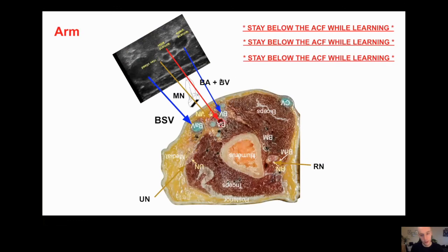This is someone's arm. This is the medial arm. You've got the humerus in the middle. You've got the brachial artery, brachial veins, basilic vein. So this is probably the biggest vein that you'll find in the arm, and all of the IVDUs, they won't know about it. You definitely can't see it because it's at least a centimeter deep, if not more. It's the first one that I'll go to, the first one that the vascular access nurses will go to.